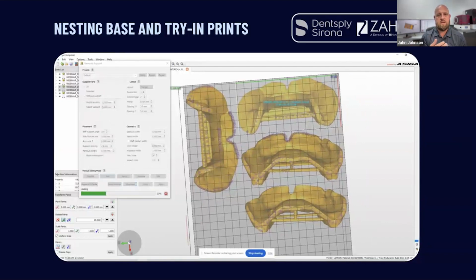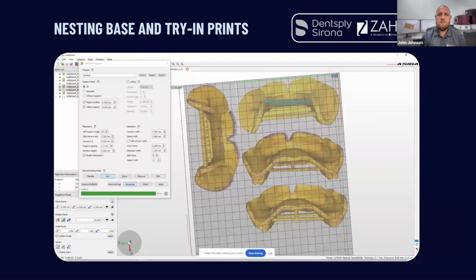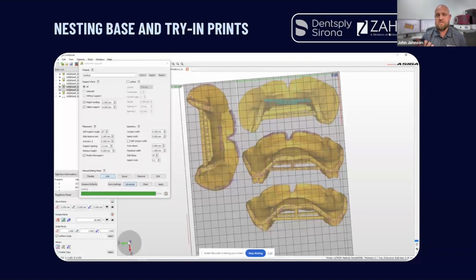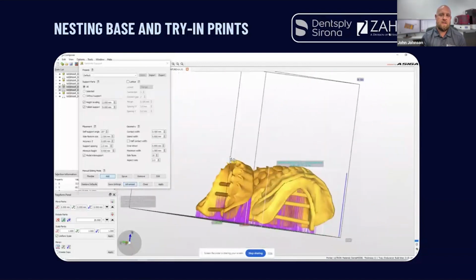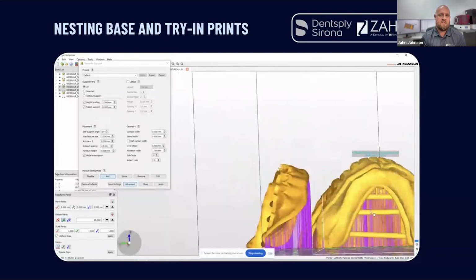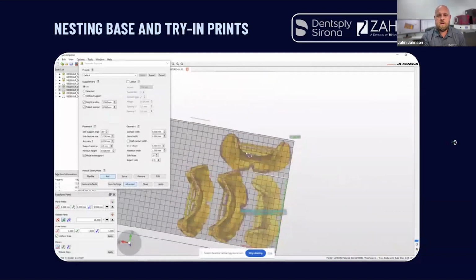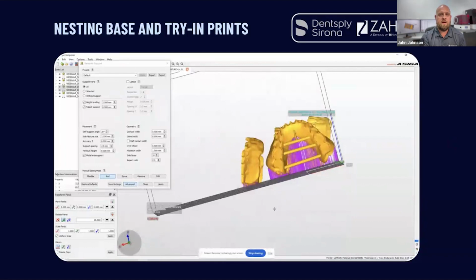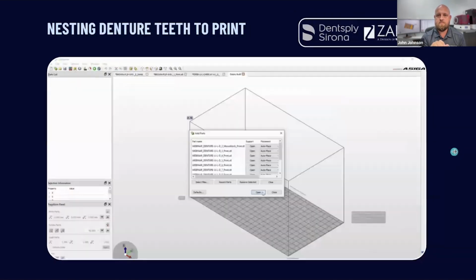So when you come into these support tools, you'll tell it that you want to suspend your print by 2 millimeters and you don't want any supports taller than this, and it'll spit out an output that potentially will print, but you still got to be vigilant and go back in and really make sure that print isn't going to fail you. I've learned to do this through fencing of those segments. And like I said, you learn what to look for. We learn very well through failure, and you learn how you fail, when you fail, and how to not do it again. And it's one of the great things about being a technician.